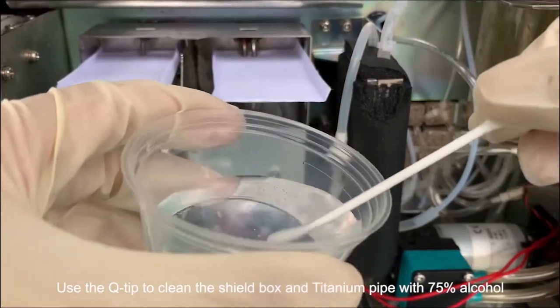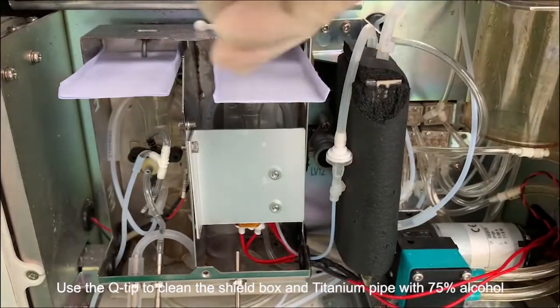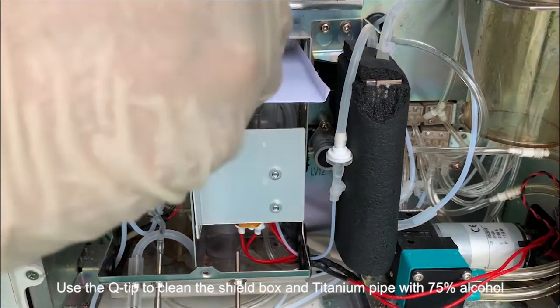Use the q-tip to clean the shield box and titanium pipe with 75% alcohol.